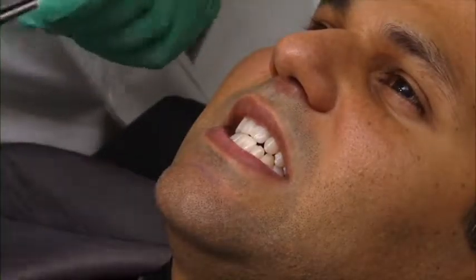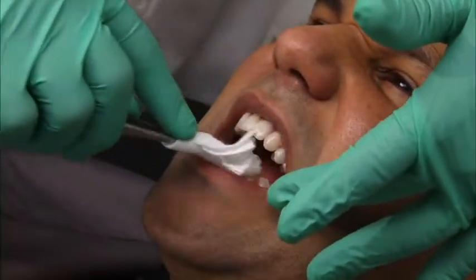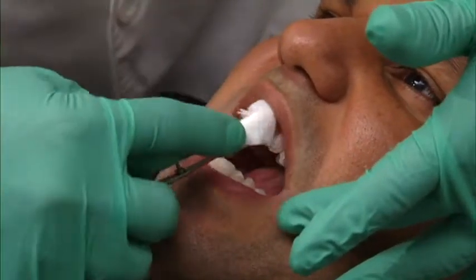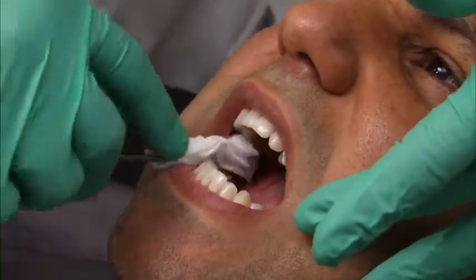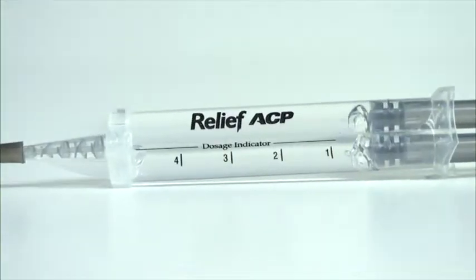Be proactive. Don't wait for sensitivity to occur. Dry the facial surface of the teeth with gauze. At this time, the teeth are dehydrated and may be sensitive to air. Relief ACP has been shown to decrease sensitivity and remineralize teeth.